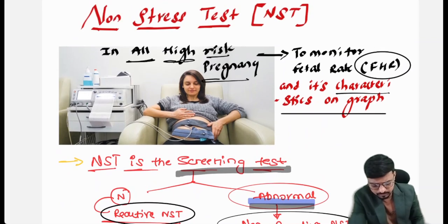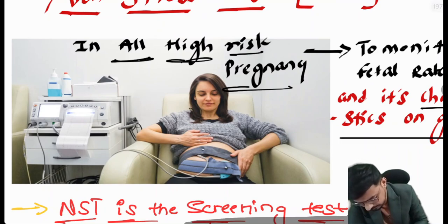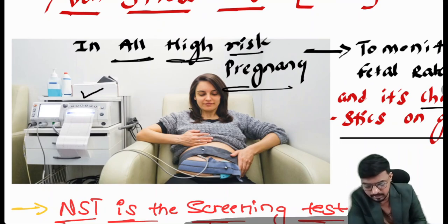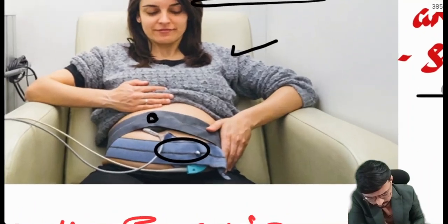So look at this image. This is the NST machine, the non-stress test machine. And here is the mother. This is the mother's abdomen. Here we are giving one button to the mother, and here is the transducer we have applied. Are you able to look at this image?